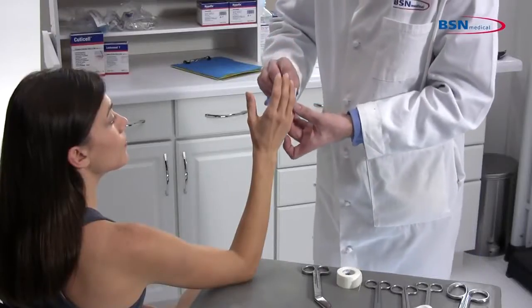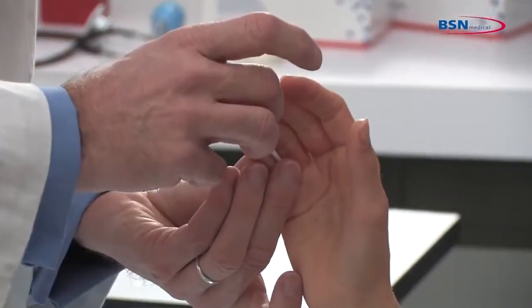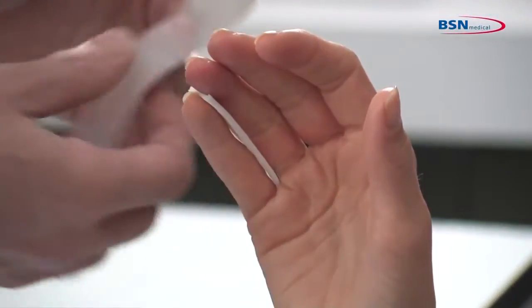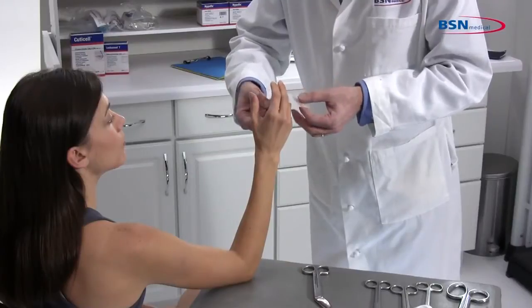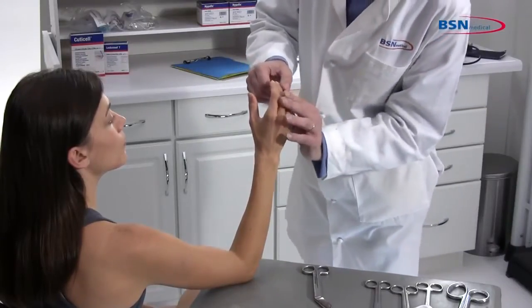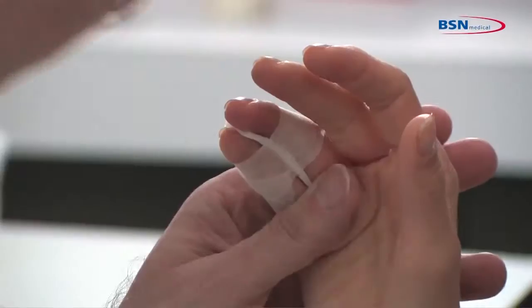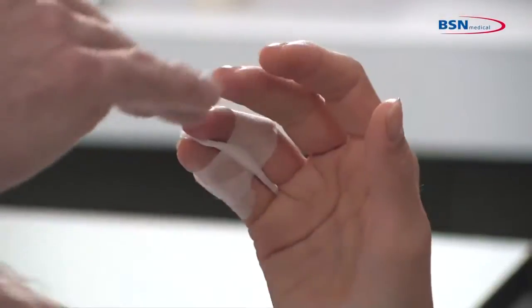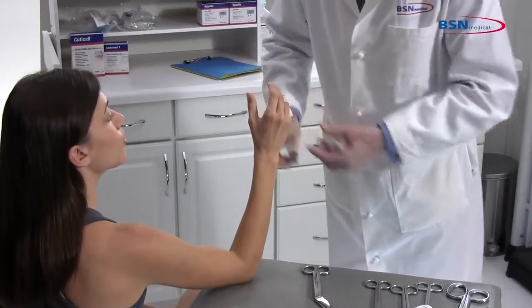Place a small piece of folded padding between the fourth and fifth phalange to provide cushioning. Tape should be used to keep this in place. Placing the limb in the proper position will assist the patient in maintaining that position during the application. Follow physician's instructions on the proper positioning of the limb.